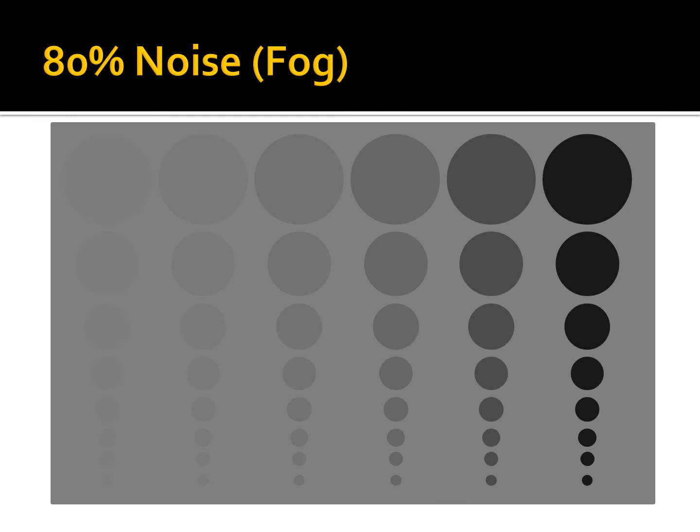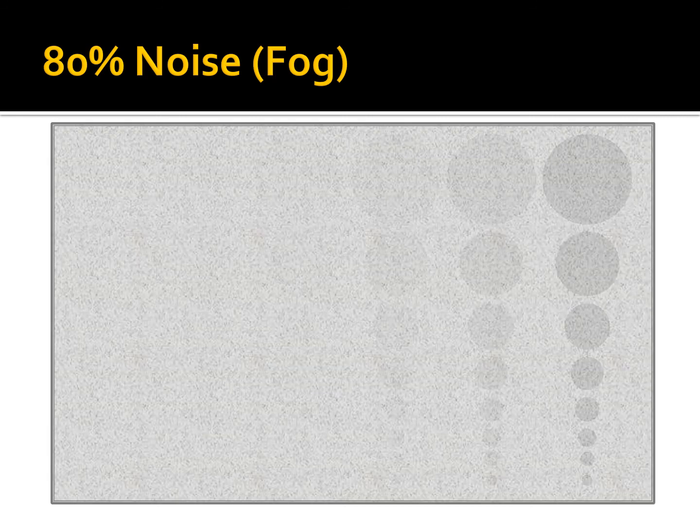Let's take one last look at the resolution matrix using the 80% noise overlay. Finally, here is the matrix without any noise. In the extreme condition, the first 3 columns are gone. In columns 4 and 5, the bottom dots are obscured.